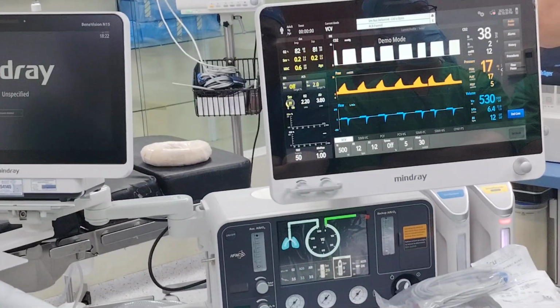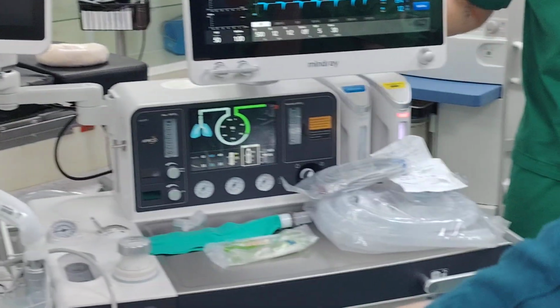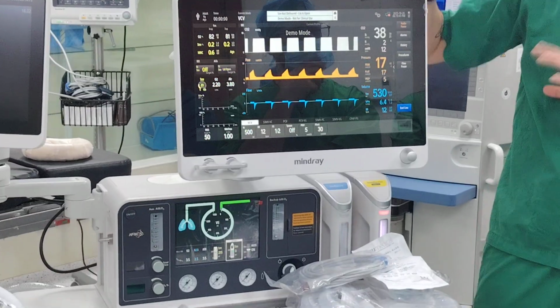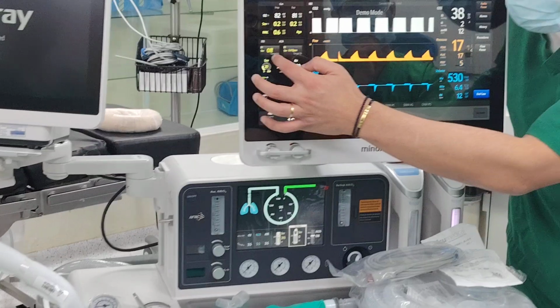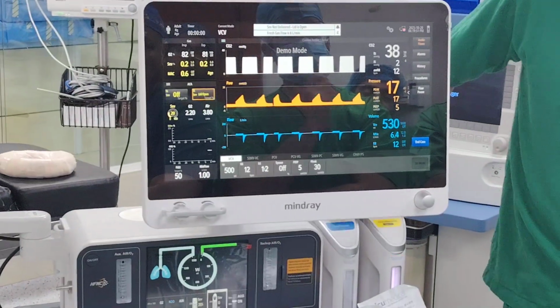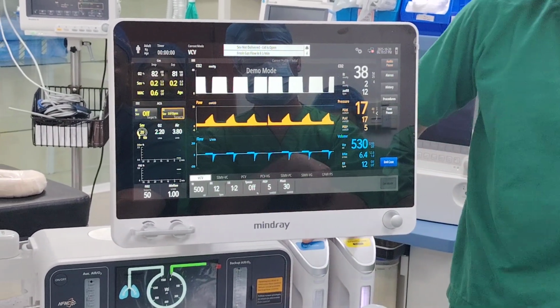So usually in the maintenance, this is so good because you don't need to worry anymore about increasing flow, increasing whatever the volatile agents, right? You have hypotension. What do you usually do? You usually decrease the settings of the machine, right? Here you decrease the target to 1.6, for example. Remember, these are targets on the patient side, not the machine. Is it clear?